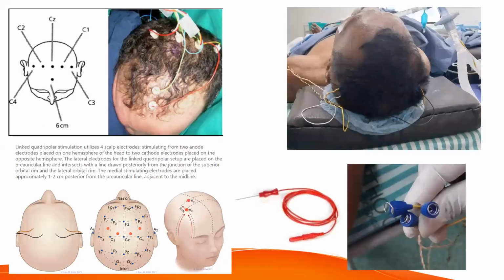Okay. In this patient, the scalp electrodes are placed for a cortical sensation. It is recorded at the CZ, C3 and C4 locations using a corkscrew electrode, and a fine needle electrode is used for the lower extremities and upper extremities.